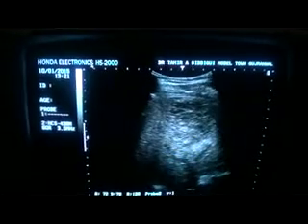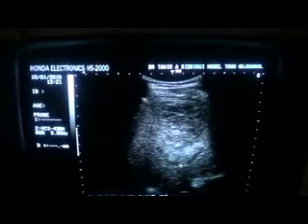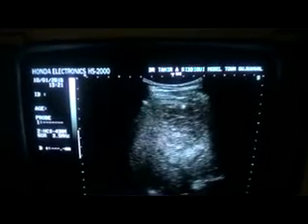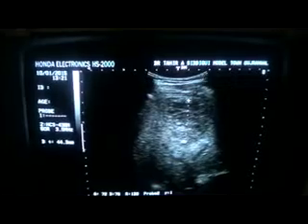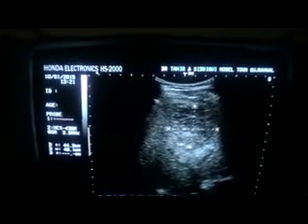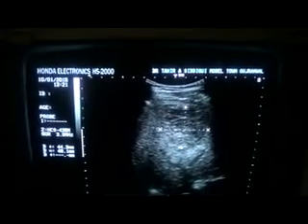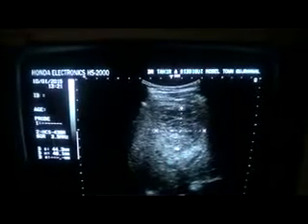Okay, this is the ultrasound of a 35 year old male. This is the liver, this is liver tissue, this is the middle hepatic vein branching, and now you see this echogenic focal lesion with internal multiple cystic areas, and the important thing to note is that the posterior wall enhancement is seen.